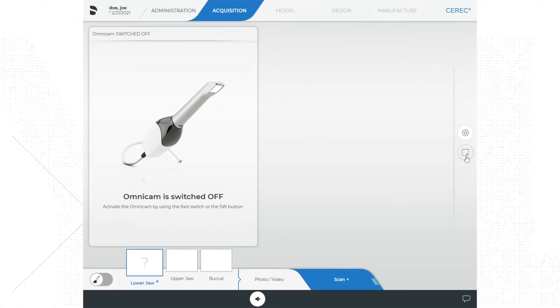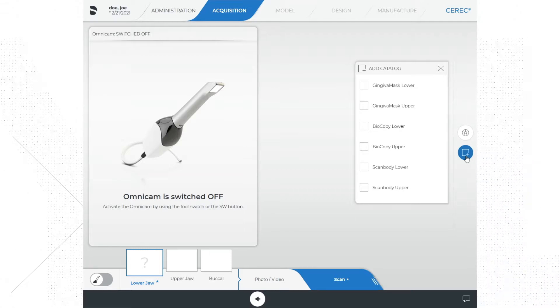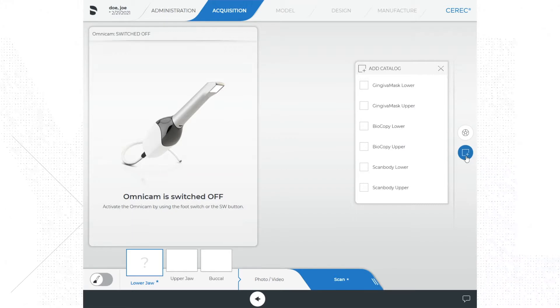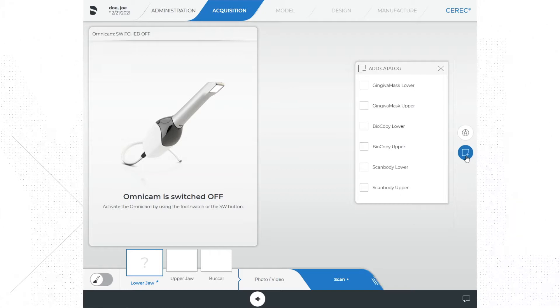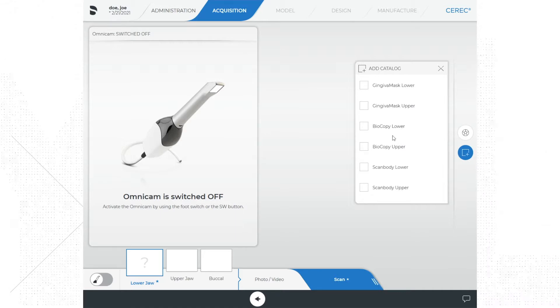Below the tools menu is a button that allows you to add a catalog if desired, indicated by the square with a plus sign icon. This is where you would add a catalog or additional scan if you were doing a biogeneric copy design mode. This is also necessary to add a catalog when working with designing implant restorations.